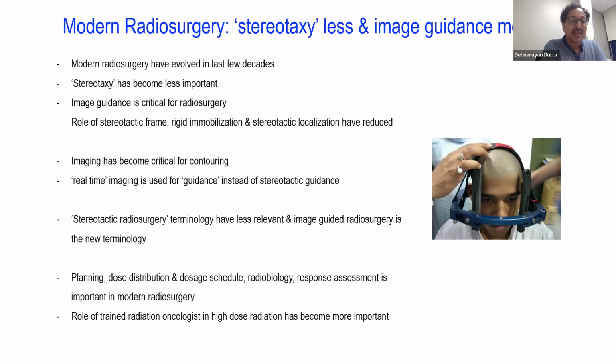Now, when we call it stereotactic radiosurgery, there is also a huge misnomer in that. The main misnomer is about stereotactic. What stereotactic? There is no stereotactic now. Earlier, when we used to put a frame, we called it stereotactic radiotherapy.